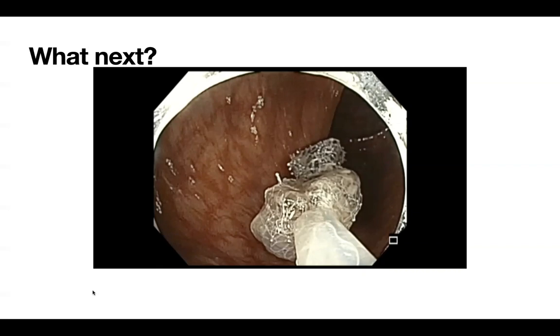And I don't want to come back with a net and then go back in. In that case, if I'm confident that this is a serrated adenoma with no dysplastic focus, because you can figure out whether there's a dysplastic focus in a serrated adenoma based on the appearance, if there's nodular appearance or whatever, then I use my snare to cold cut the resected polyp into 2 pieces, and then suction those 2 pieces, and then move on with cutting more polyps.